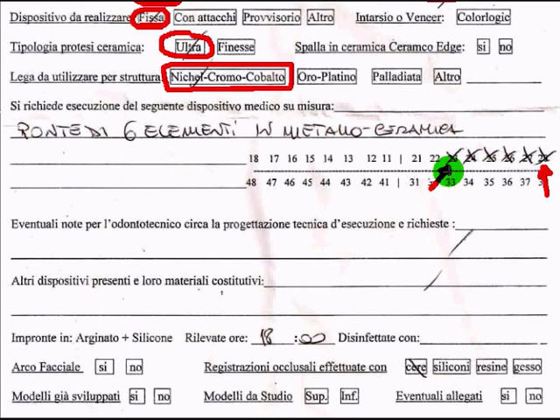The request is to build a six-unit metal ceramic bridge from a canine all the way back to a wisdom tooth — six units total. This is the first key information I get from the prescription. The prescription also has space where the doctor can write technical notes about the project and any specific execution needed, but there's nothing written there. It can also note any other devices or materials in the patient's mouth, but that hasn't been filled in either.